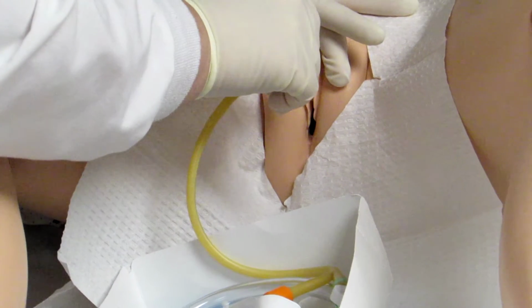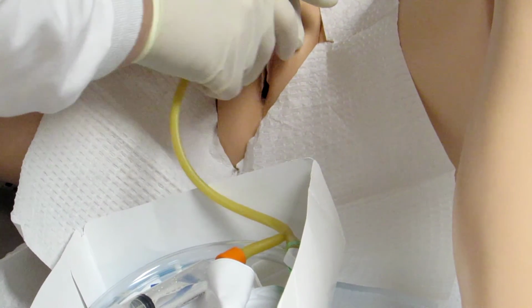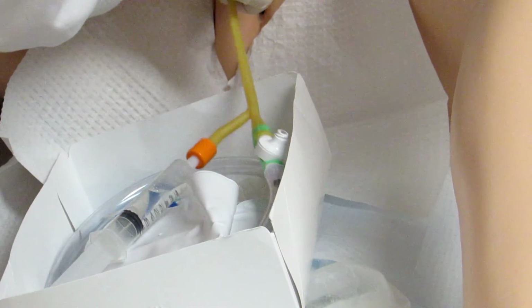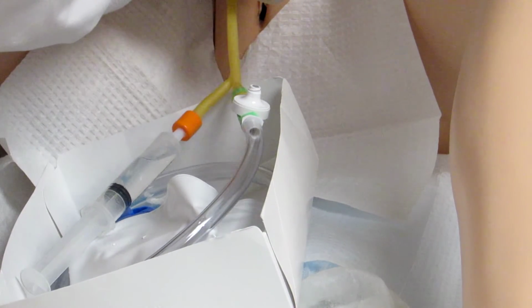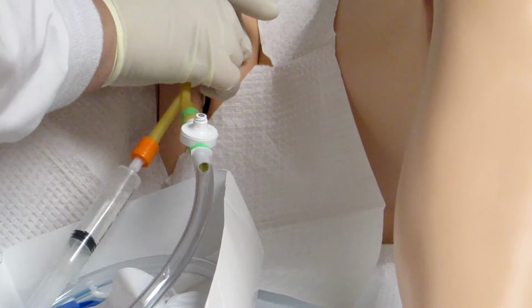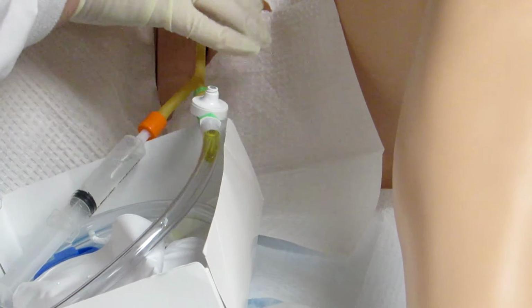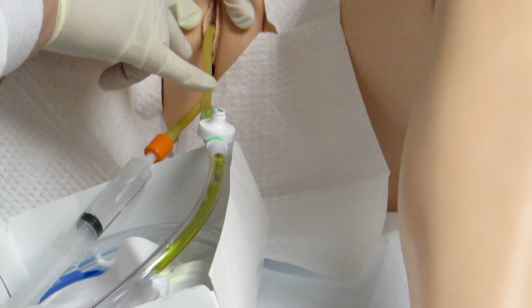Mrs. Johnson, I'm inserting the catheter. It's going to feel a little bit of a pinch. I'm going to insert until I see urine come into my catheter. Remember, for females, it's not going to probably be too far, and for men, it's going to be a little bit longer. So here you can see my urine flow right here. It wouldn't usually go this far into a female before you'd see that.